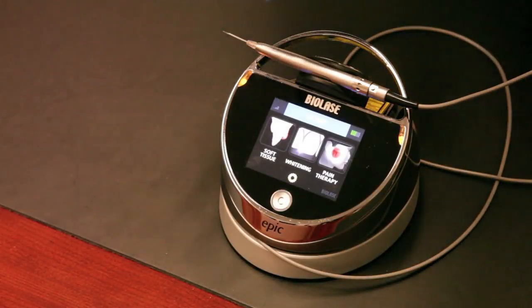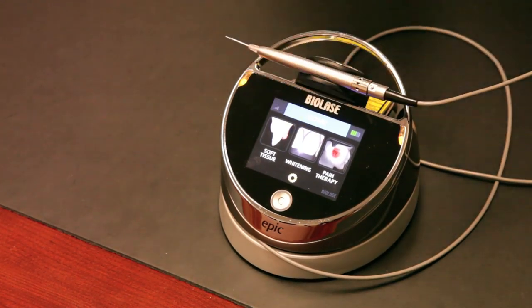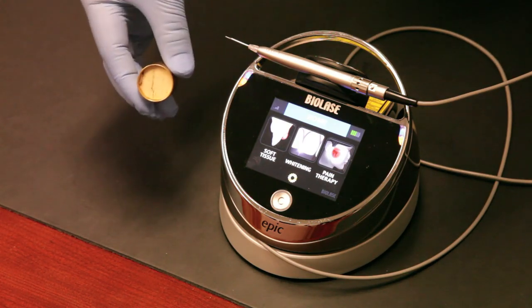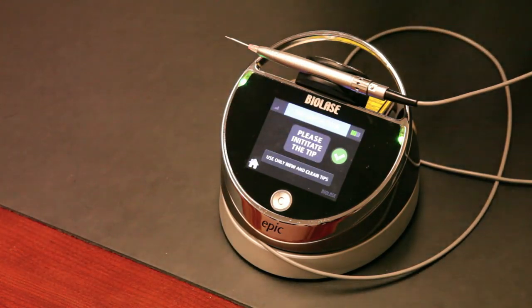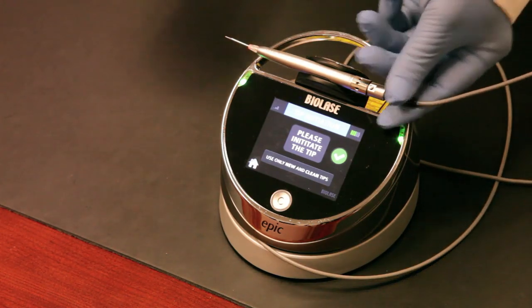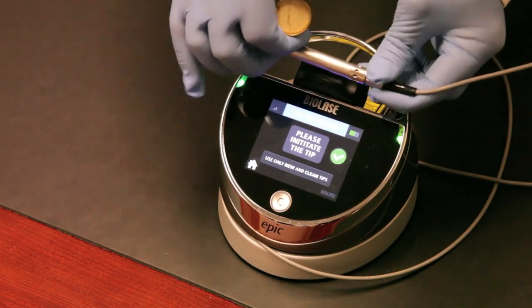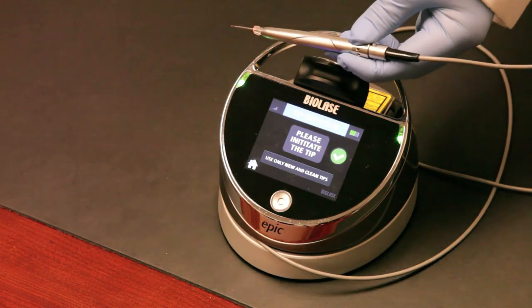Now I want to show you how to initiate the tip — you'll be doing this quite a bit with most dental procedures that require cutting gum or soft tissue. Here's the cork inside the tip initiation kit. Go to your procedure — we're doing a gingivectomy again — and it will prompt you to initiate the tip, which is a great chairside reminder. Always wear safety goggles: whenever the laser is in ready mode, everybody in the room needs protective eyewear at all times.